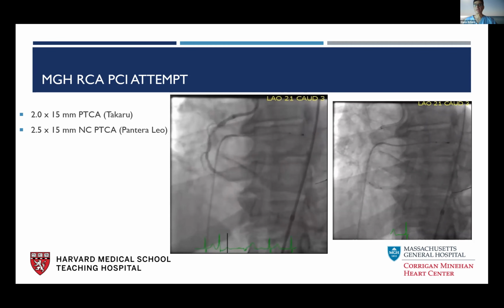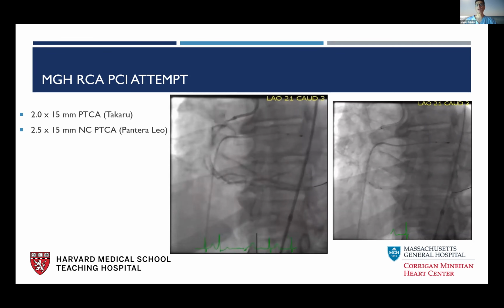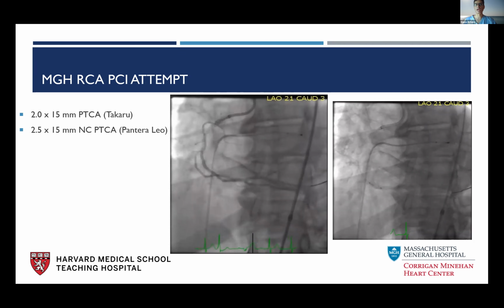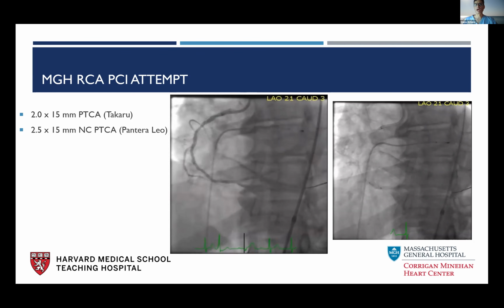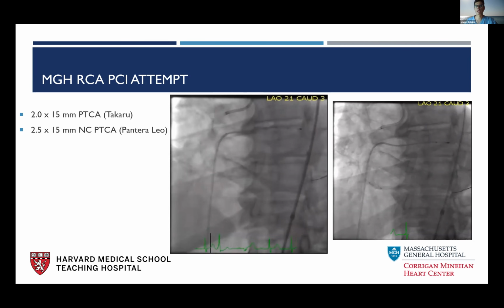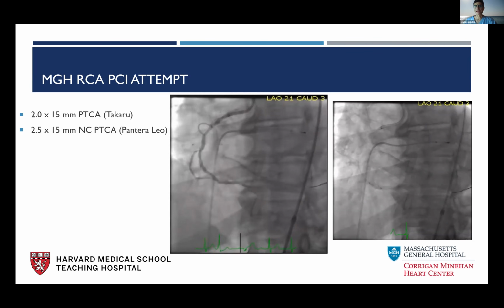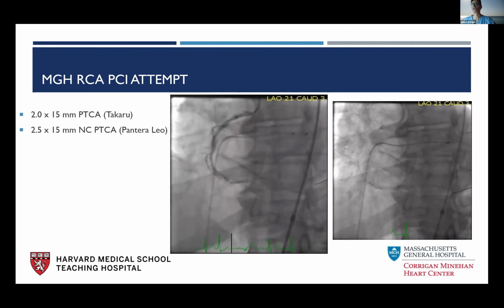Yeah, actually, there's no published data, but it does work as well. It essentially works eccentrically on the side. Now, many people consider rotational atherectomy preferred for uncrossable lesions, but I think CSI could work on those as well. The one potential difference here might be that they had tried several things before that didn't work. They also had a temporary pacer, so Orbital might have less chance of causing bradycardia, but they already had to put in a temporary pacer. That's less of a consideration over here.